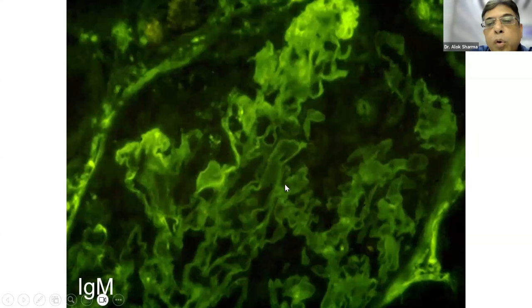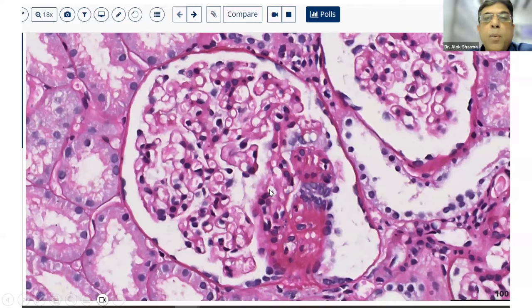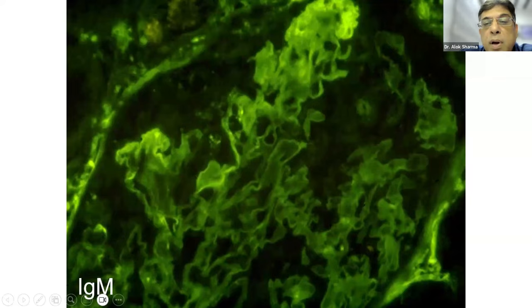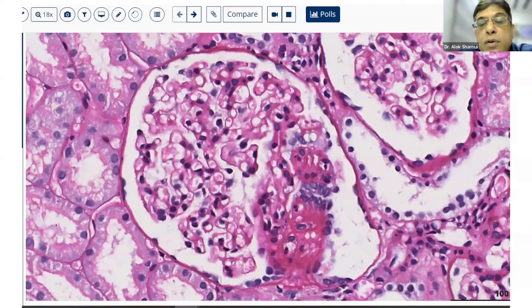Okay, so it can be vascular pole also, but the point is there is sclerosis here. So there is loss of capillary architecture. So that is what I was coming to. When there are subtypes, I'll come to that vascular pole part. But vascular poles will not show you areas of confluent sclerosis and adhesions of glomeruli. That's one part. Secondly, the vascular pole will not show you prominence of podocytes as we are seeing.